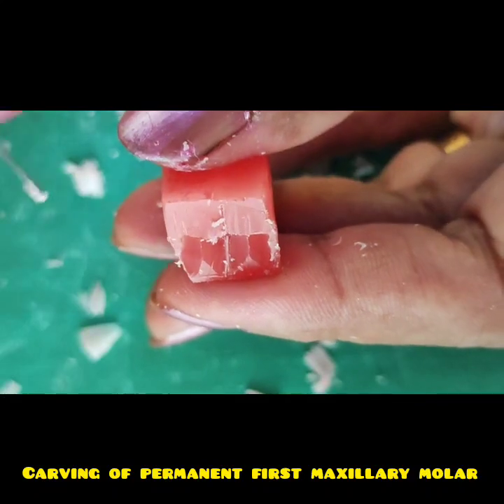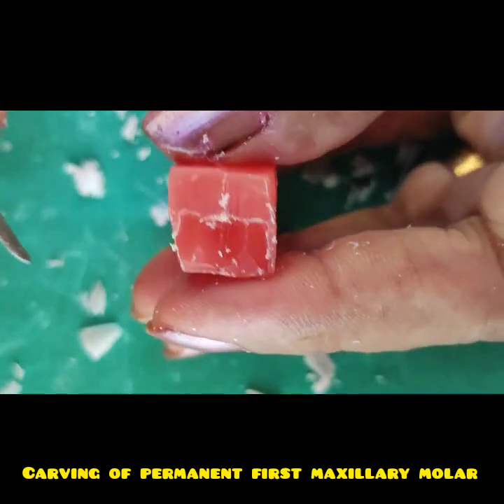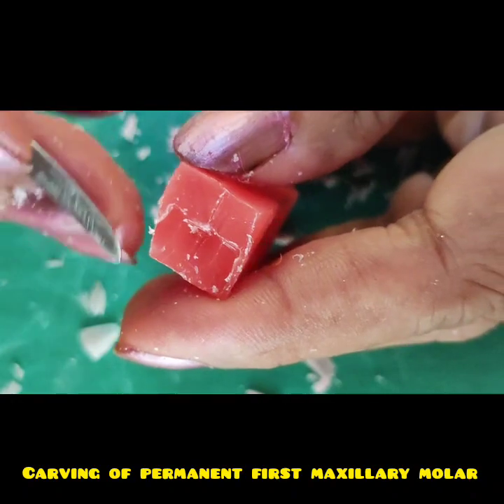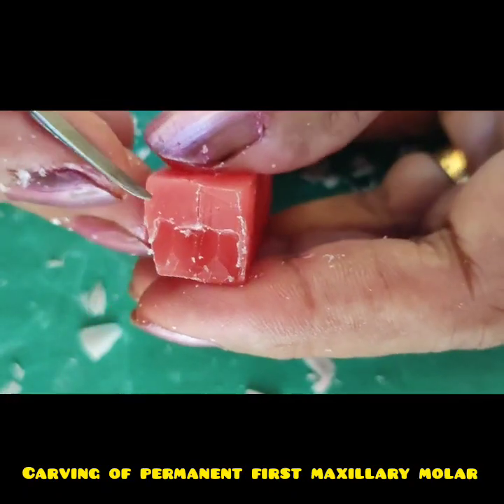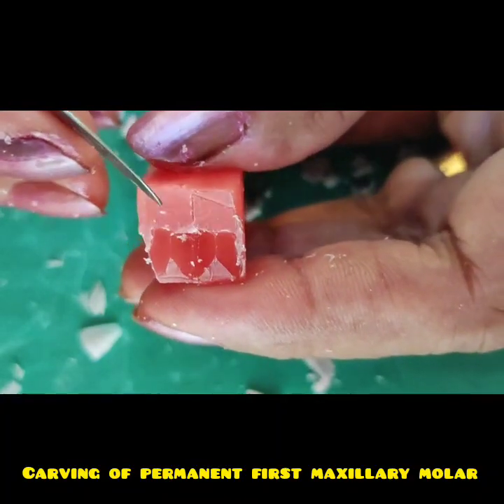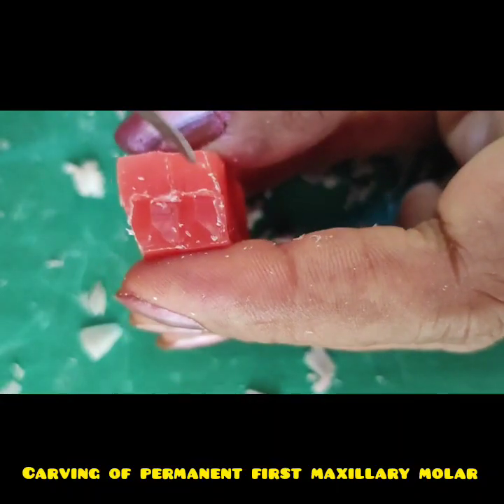There should not be extra waxing at the junction. So nice, two cusps I've carved. Now this part is a little tricky, but I will explain it in a simplified manner. First we have to carve the mesiopalatal cusp, which is the largest cusp, and it will be placed here on the obtuse angle.